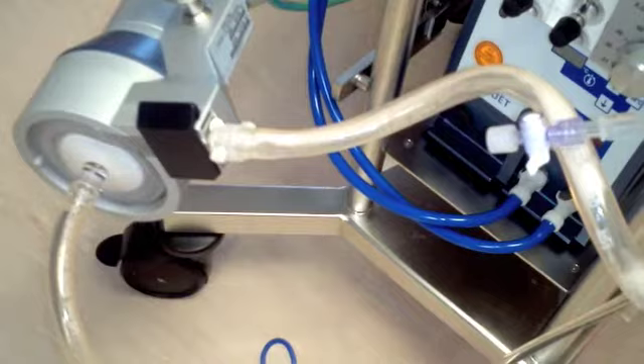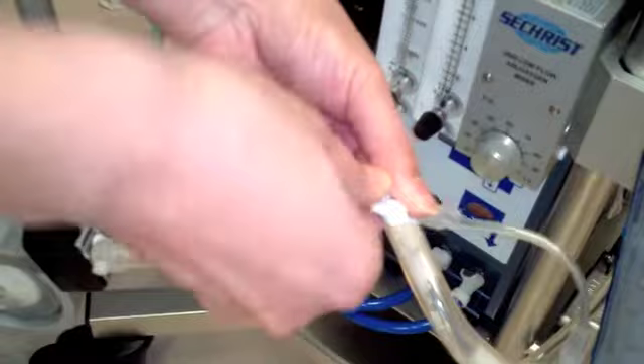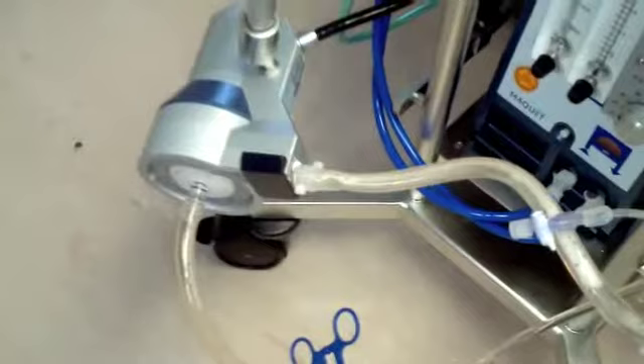As you can see, air is gradually collected in the priming bag. This will ensure that any air bubbles will be removed. Don't forget to prime the extension lines also. Air bubbles are still found in the circuit, and that means the priming is not yet completed. Make sure that there should be no bubbles in the tubings.